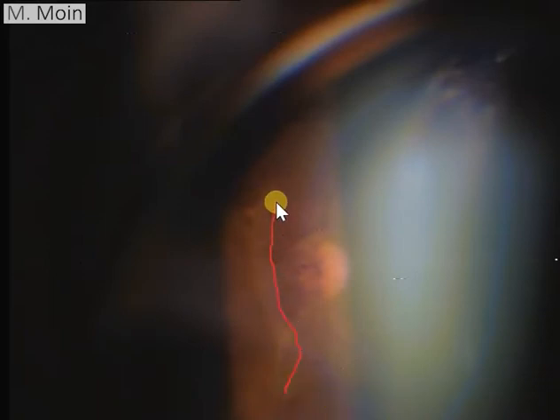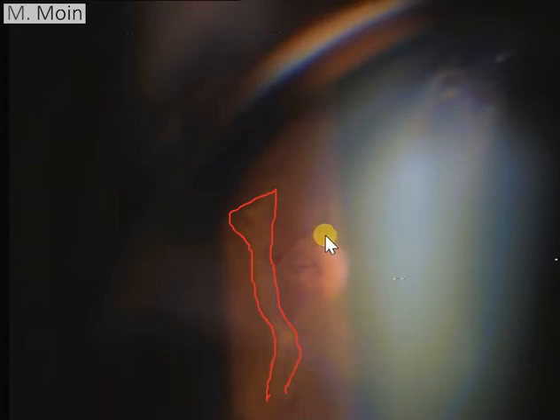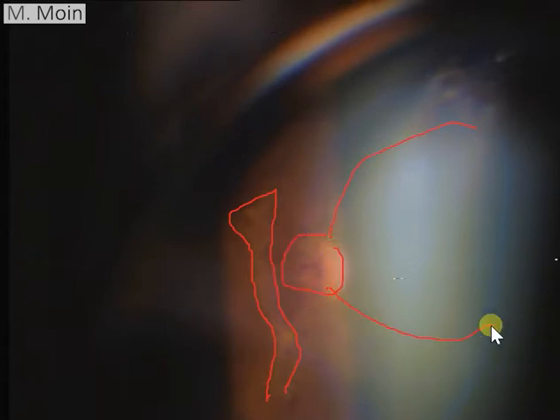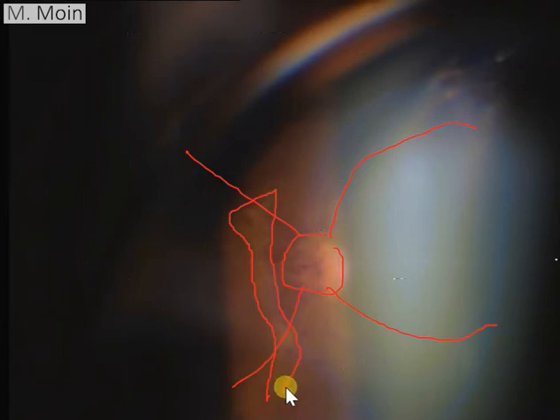He had this area of whitish band which you can see over here, so this is an area of tractional band. This is the patient's right eye, so what you're seeing is an upside-down picture of the patient. This is the temporal side, so this is the nasal side.